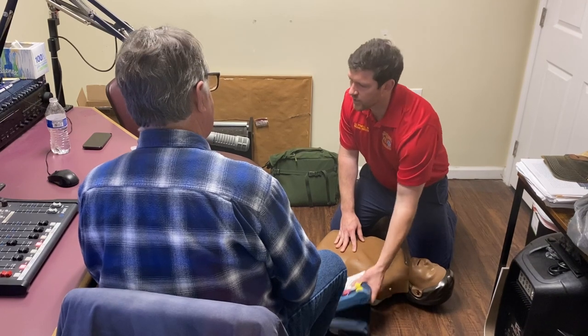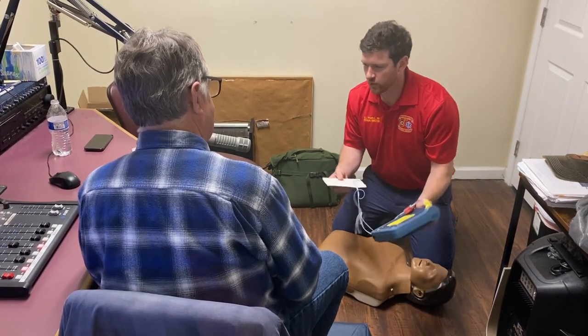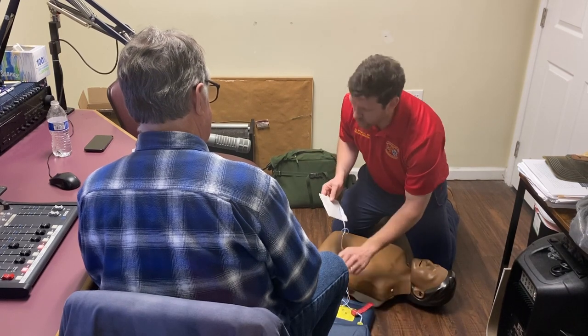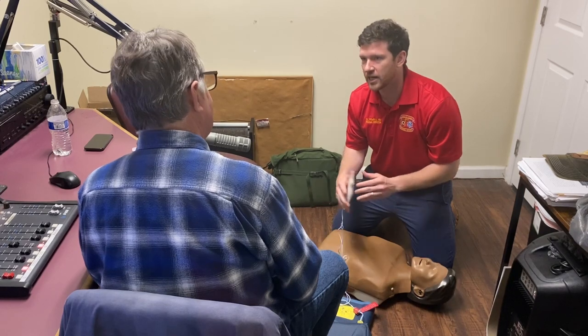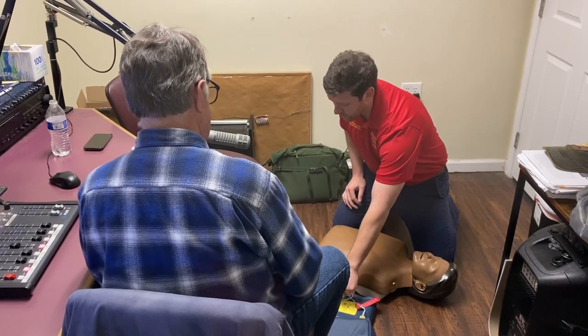It's a device — just a machine. They bring it to you, and I just took it out of the packaging. The nice thing is the moment you turn it on, it tells you exactly what to do. You could never have seen this before in your entire life — somebody hands it to you, you open it up, and it's going to tell you what to do. I'm going to turn it on for you.